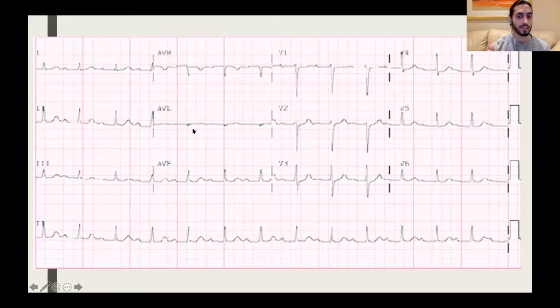are very hard to get, and it takes a bit of time to learn it. This is first degree heart block, systematically. Rhythm, fine. Sinus rhythm. This does count as sinus rhythm, by the way, because technically you have P waves, you're not dropping a QRS. P waves are followed by a QRS every single time. So this is sinus rhythm with first degree heart block.